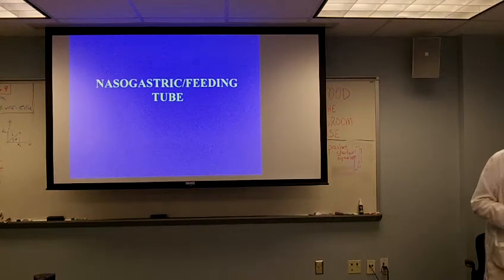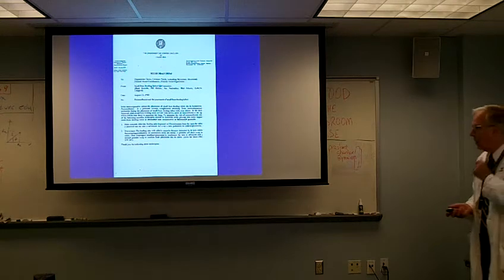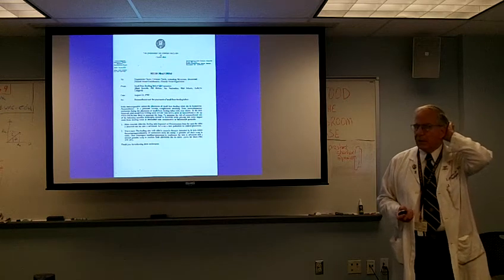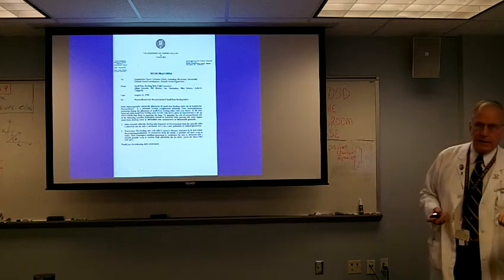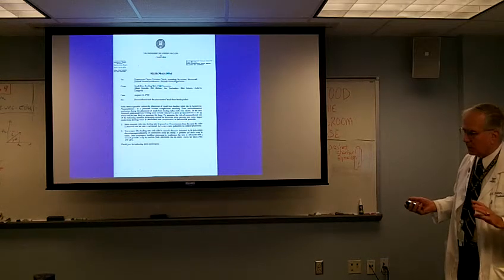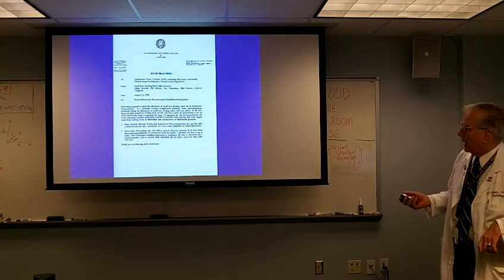Nasogastric tube and feeding tubes. In this hospital, some years ago, we developed a protocol for how to place a feeding tube in a patient who was intubated or had an impaired gag reflex. Unfortunately, I wasn't involved in making this decision, or we might have done things a little bit differently, and I'll show you why in a few slides.